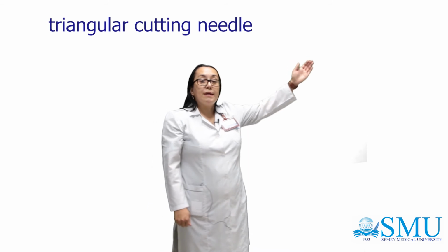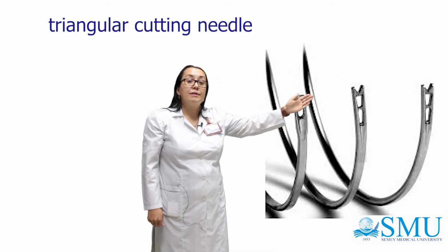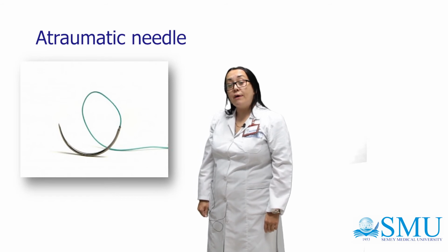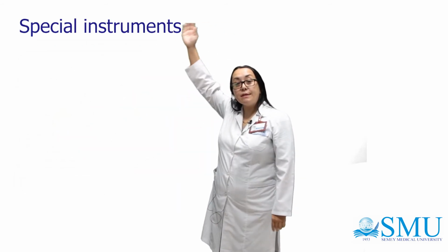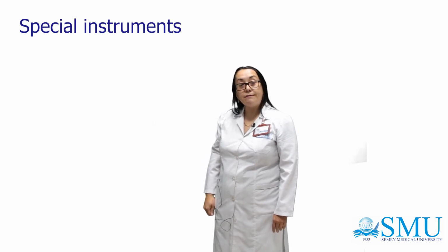Next is triangular cutting needle, used for tougher tissues such as skin. Atraumatic needle, used for vascular sutures. Special instruments. Special instruments used for narrow specialized operations. So these are the retractors used for abdominal operations.